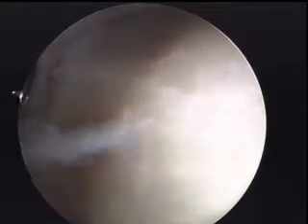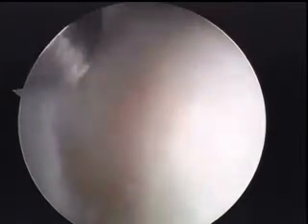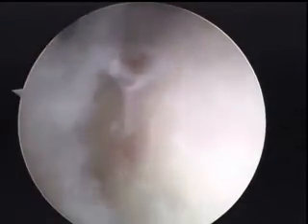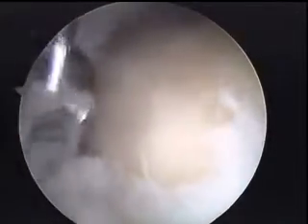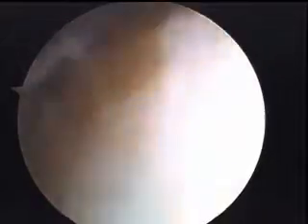Post-operatively, due to this, we're going to put the patient on crutches for about 4 weeks with 50% weight bearing, which means they can put some weight on it, but not all. This is because we have weakened the hip itself by taking this bone off. This is a lot of the cortex of the femoral neck, so it does support quite a bit of his weight. So in the 4 weeks that he's on crutches, it will allow his hip to remodel and become stronger and prevent any risk of hip fracture if he slips or puts too much stress on it. This would be our main worry for complication.